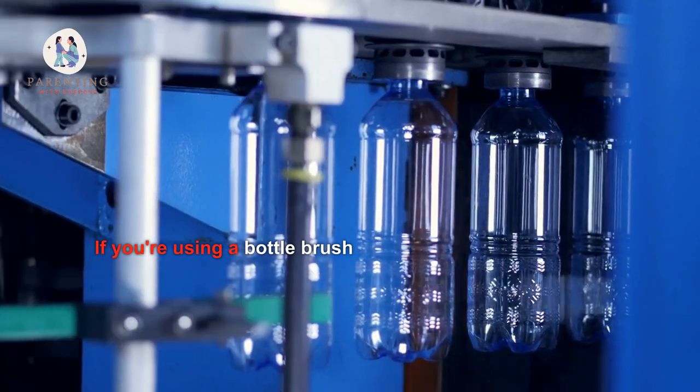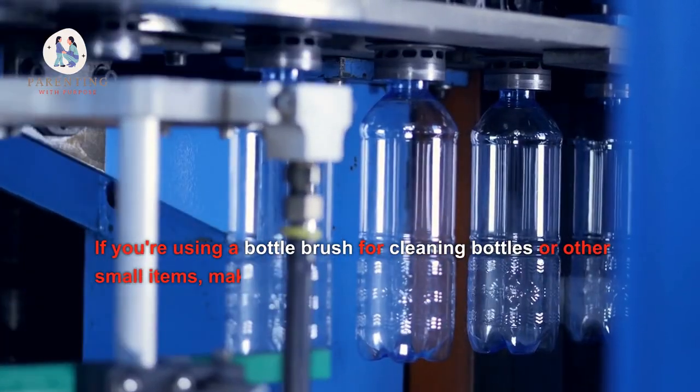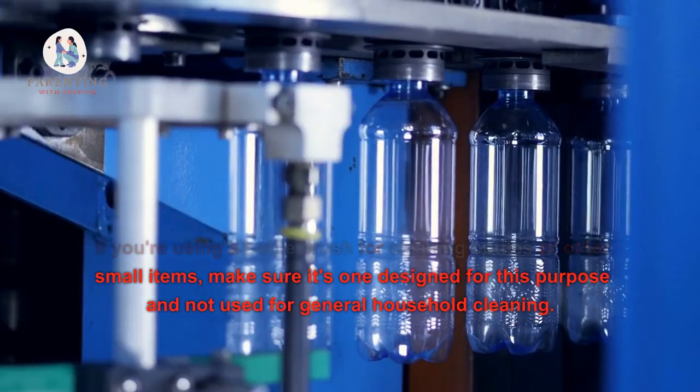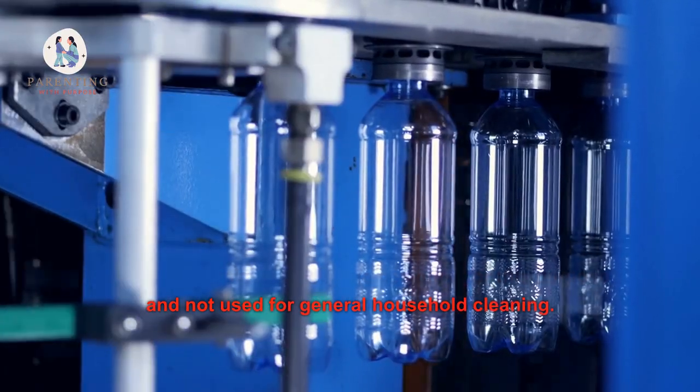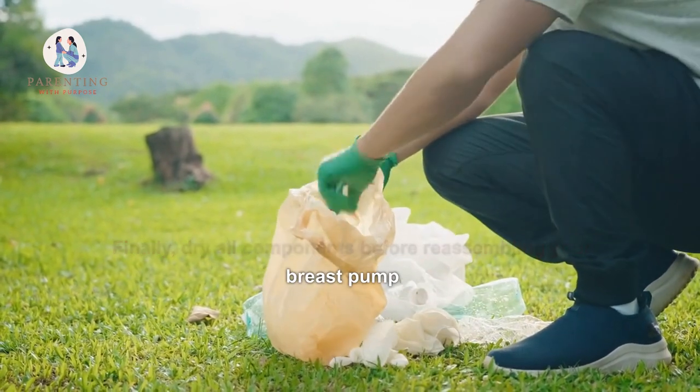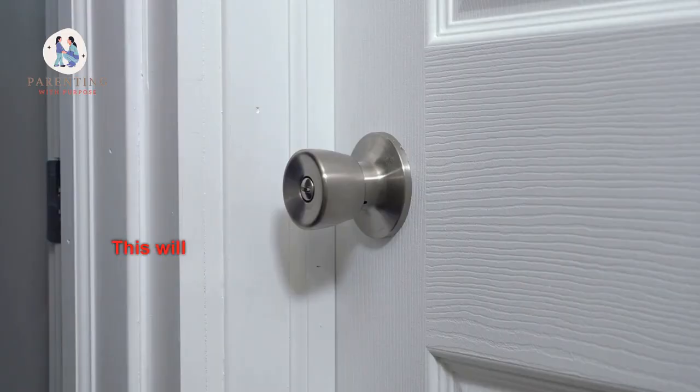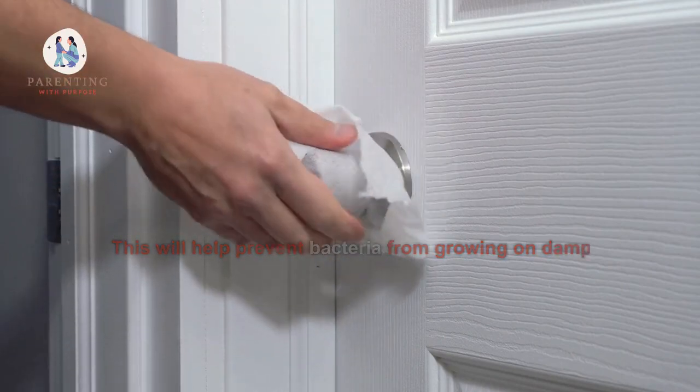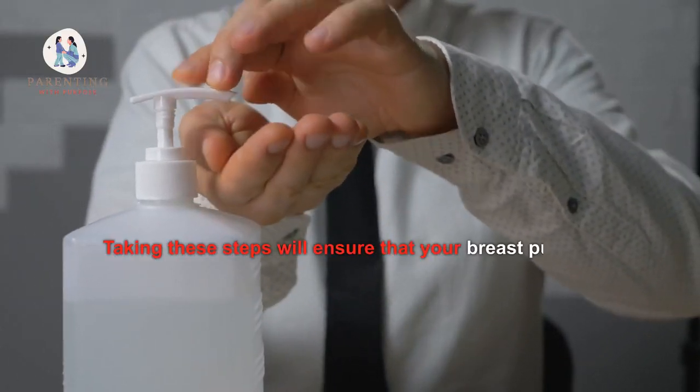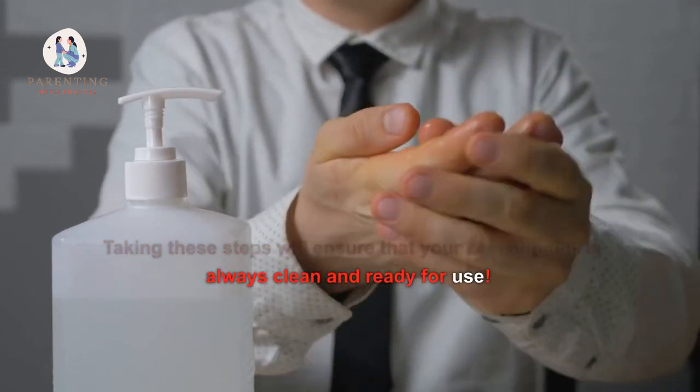If you're using a bottle brush for cleaning bottles or other small items, make sure it's one designed for this purpose and not used for general household cleaning. Dry all components before reassembling your breast pump. This will help prevent bacteria from growing on damp surfaces. Taking these steps will ensure that your breast pump is always clean and ready for use.